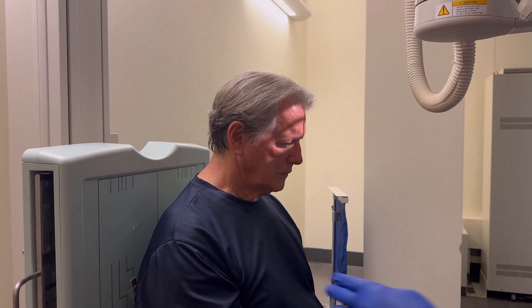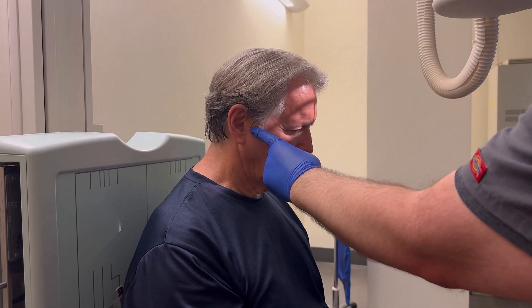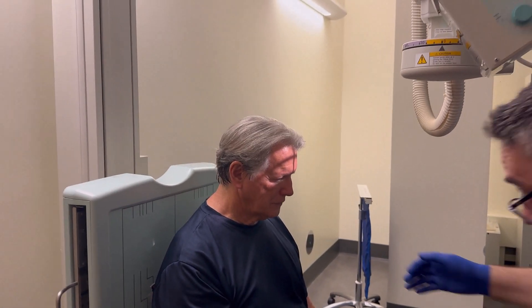If you ever have trouble finding the TMJs, you can put your finger right in front of the EAM and have the patient open and close their mouth. Go ahead and do that. You can really feel it right there. That's how you're going to find it if you're not sure.